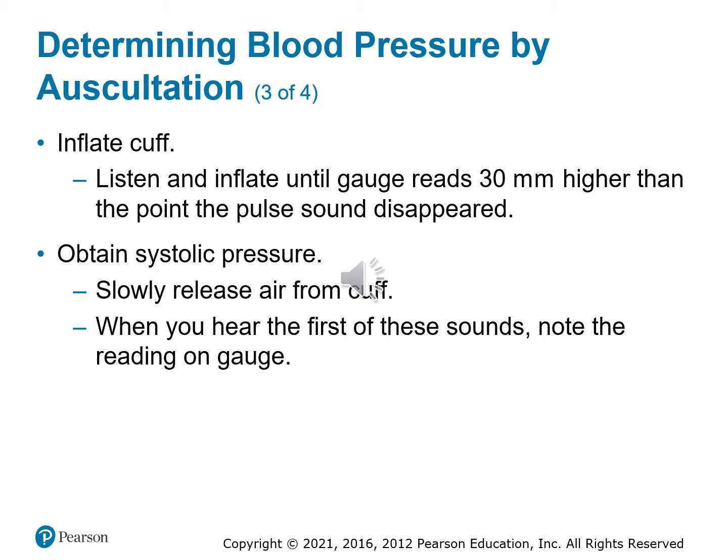But it's one of those things, the more you do it, the better you're going to get. So when you first start doing it, really let that air release slowly from the cuff, so that you can make sure that you hear that first thump. As you get experienced and you do it more, you'll be able to do this process fairly rapidly. But in the beginning, until you get some confidence, that's what I would say. Just go nice and slow.